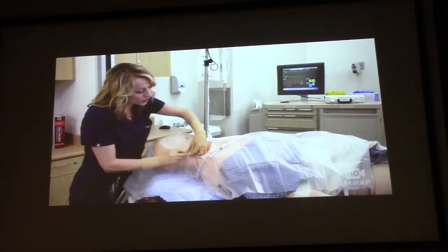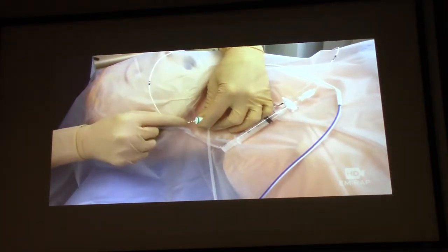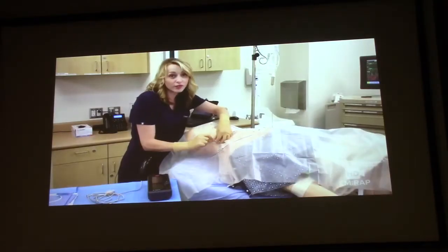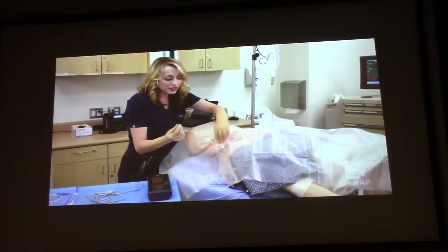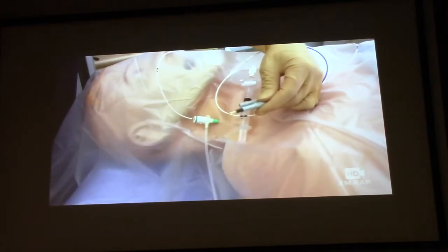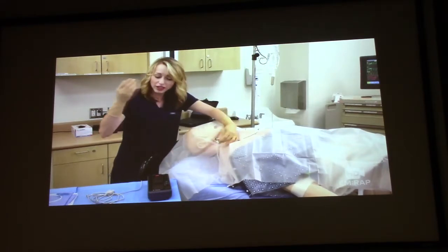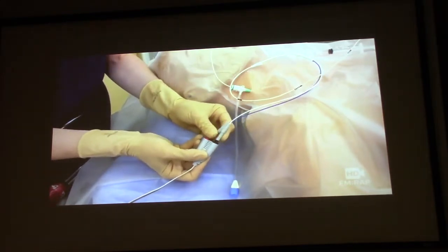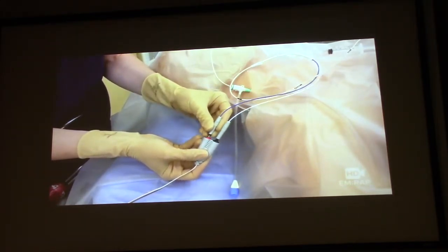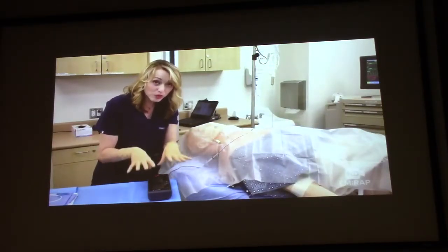So for now, you're going to continue inserting this wire until you get to the 20 centimeter mark, which is indicated by the two black lines on the wire. Now you know that the tip of your wire, and therefore the balloon, are just outside the cordis sheath. That's a good thing. We don't want to pop that balloon. Now we can connect the adapter pins to our pacing wire. And these are going to get plugged in to our connecting wire over here. And negative goes to negative, positive goes to positive. Remember, this is not sterile, so you want to have an assistant help you with this portion.